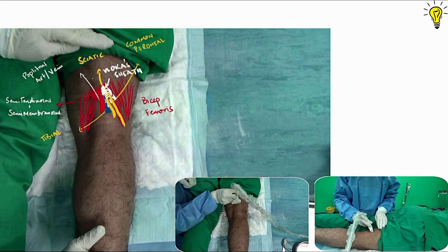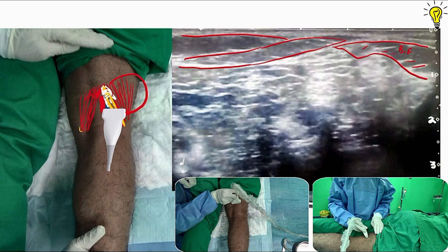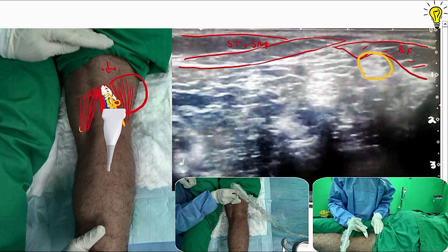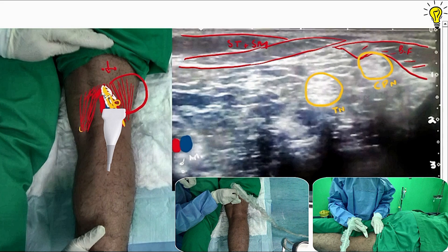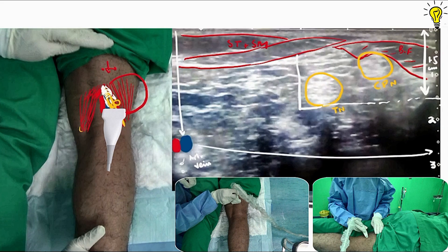Let's see how these structures appear on the ultrasound screen. Make sure you have a good lateral-to-medial orientation on the ultrasound machine. Laterally and superficially, the bulky muscle is biceps femoris; on the medial side we can see semitendinosus and semimembranosus superficially. Running right below the muscle and slightly laterally, you can see the laterally located common peroneal nerve, and medial to it is the tibial nerve. The artery and vein are in deeper layers in the medial aspect of the popliteal triangle.